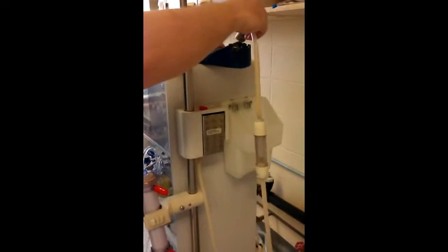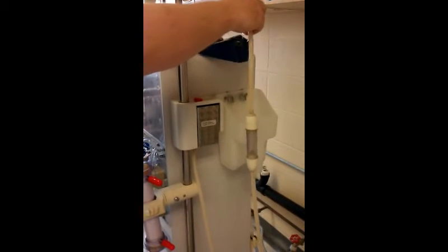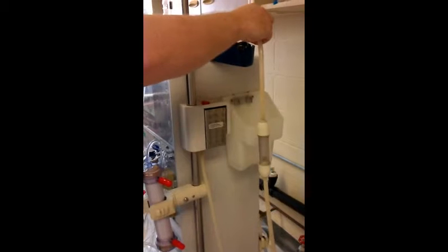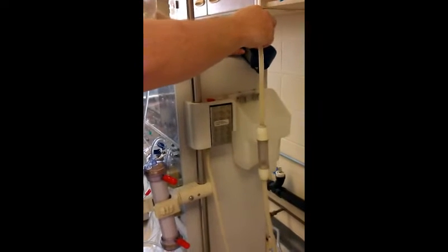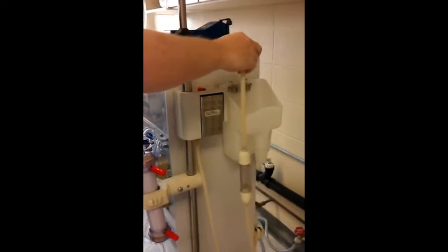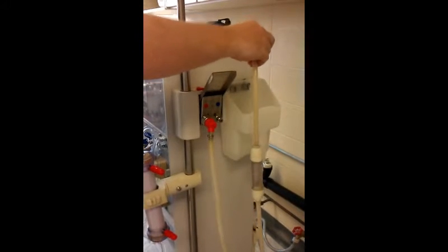Fill up both of these wells, rinse them out one, two, three times, and then on the fourth one go ahead and leave them full. Set it right there. Reach over and stop the flow.